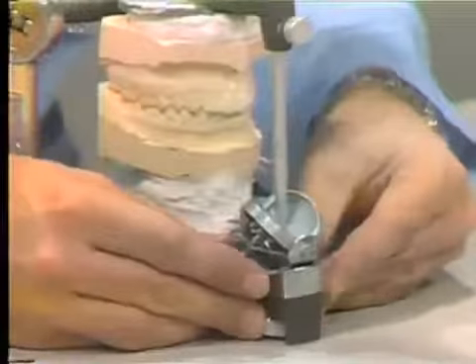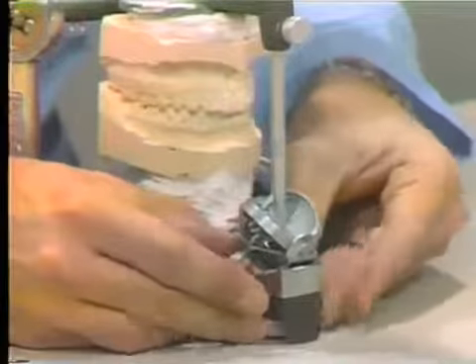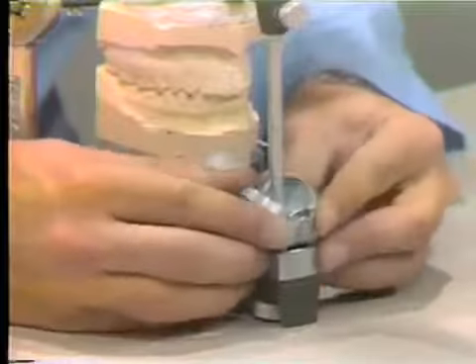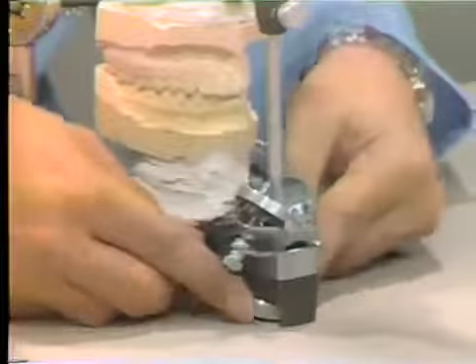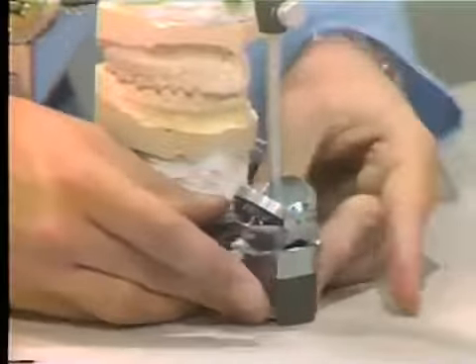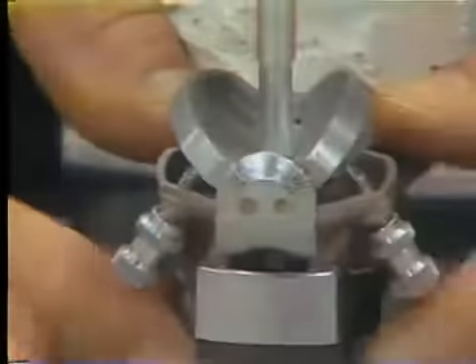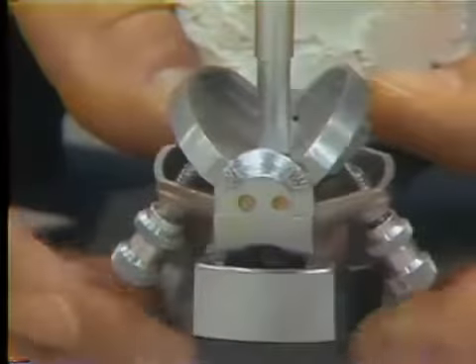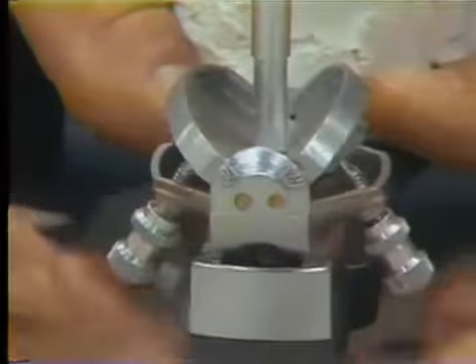First thing we do is loosen the thumb screw on the bottom of the articulator, and set the incisal table at 0, or let it be horizontal. I'm going to now tighten this so that it doesn't move.